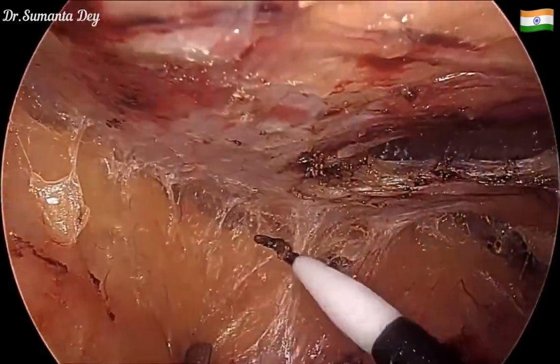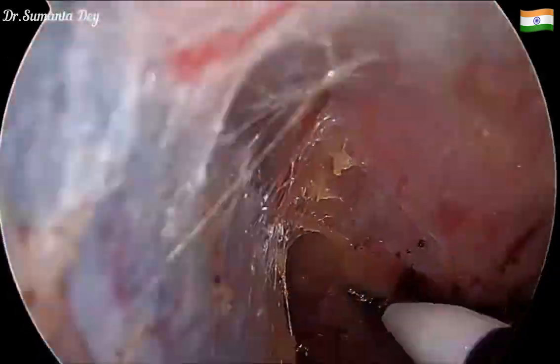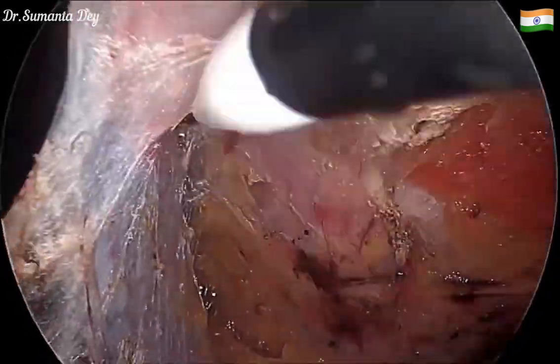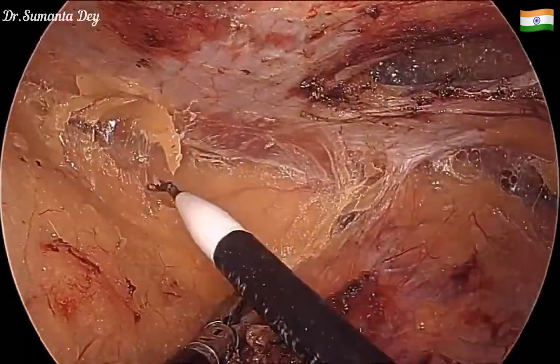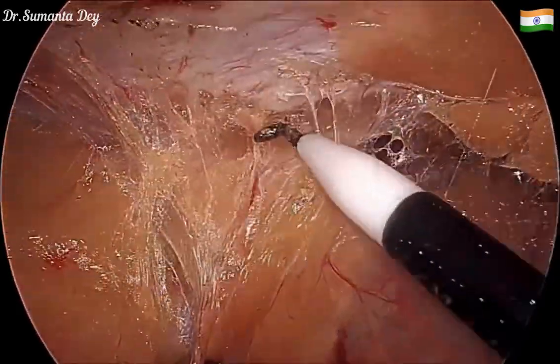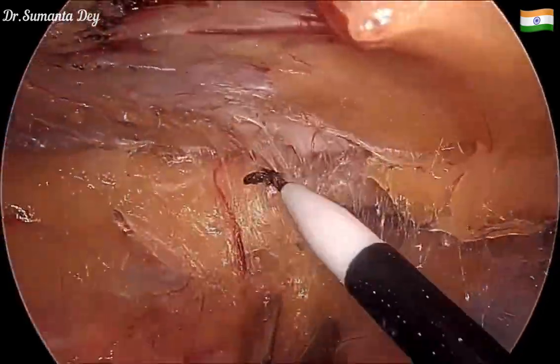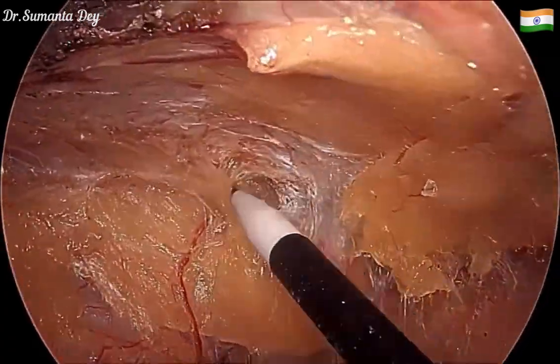The idea is to create at least five centimeters of preperitoneal space all around the defect so that I can place an adequate-size mesh in the preperitoneal plane. Going onto the lateral abdominal wall, gradually towards the space of Bogros, the plane is further created.